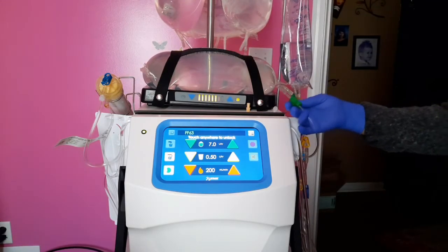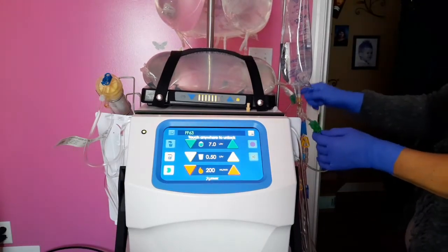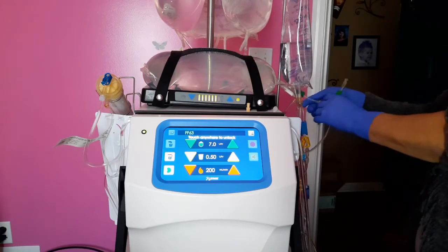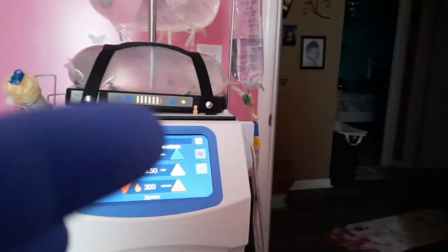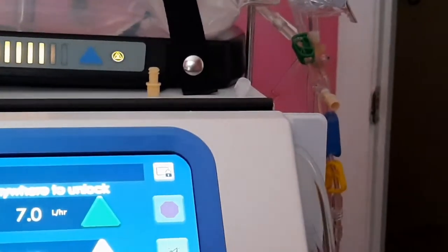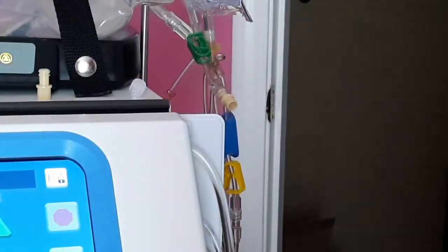You're going to take your clamped dialysate line and find your clamped dialysate line on your bag that's on the warmer. Okay, I don't know if you can see. There we go. Lord, gotta babysit these things.